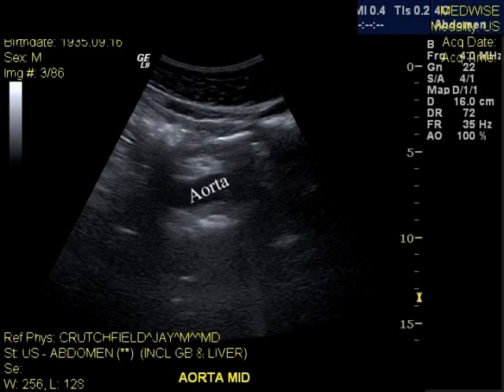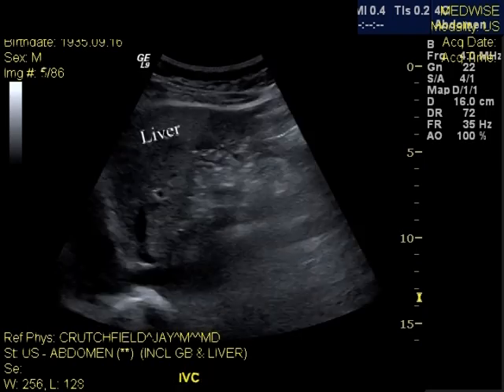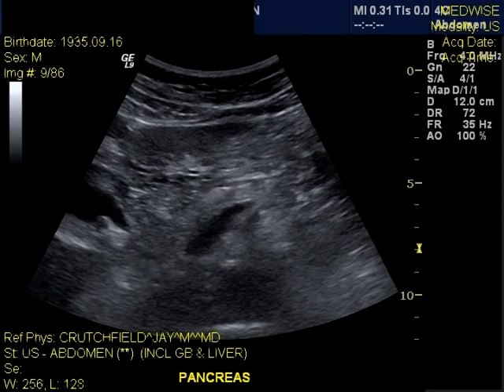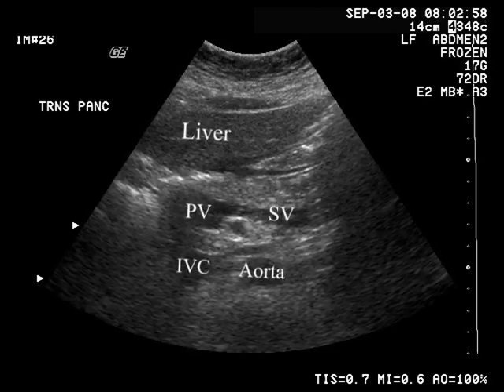This is ultrasound of the pancreas. We're not trying to get you to read an ultrasound of the pancreas and to argue with the radiologist. We're trying to get you to recognize normal anatomy. We'll start by showing you some ultrasounds from my actual patients, labeling them, and then leaving enough room at the end of each image so that you can actually stop, look at the video without the labels, and try to quiz yourself to see if you can read these ultrasound images.